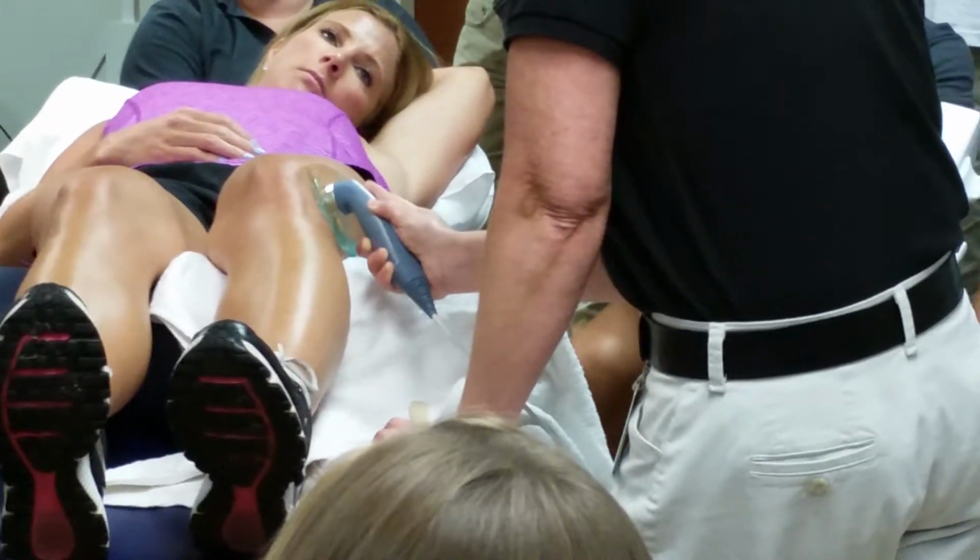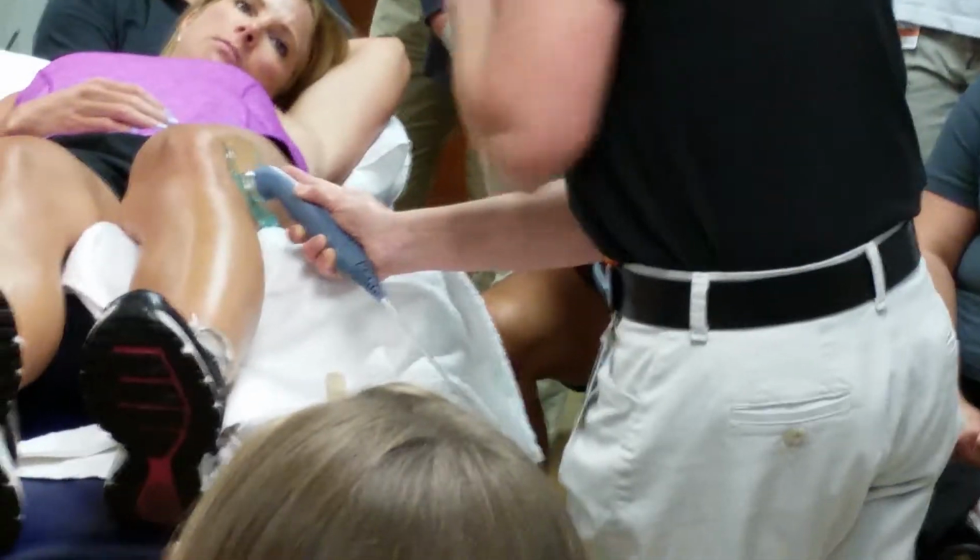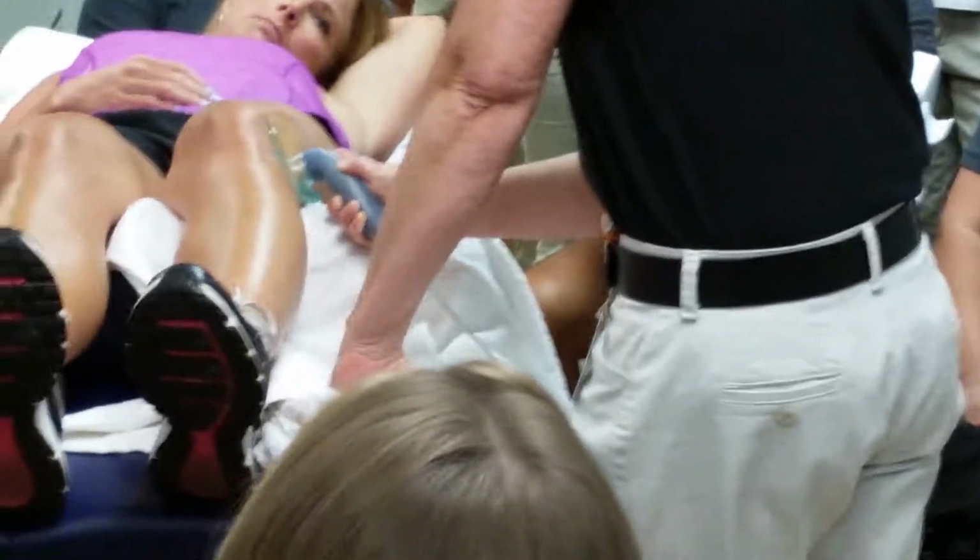How high are you right now? I am at 0.7 watts per centimeter squared. So in general, when you first turn it up, you guys turn it to 0.5 and see what happens.